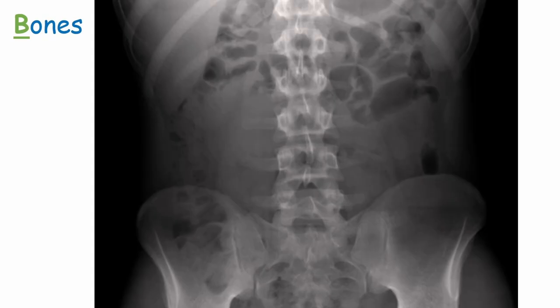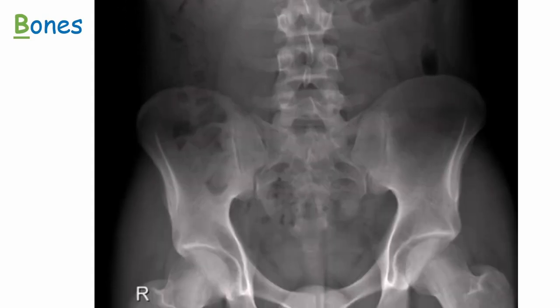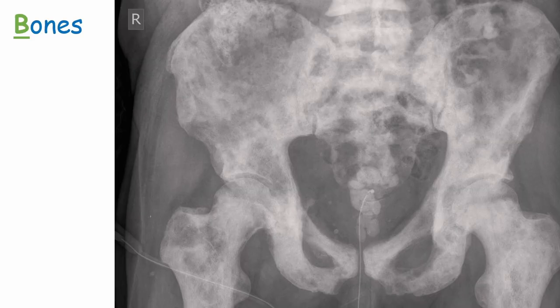The next B is for Bones. On an abdominal x-ray we should be able to identify the lower ribs, the five lumbar vertebrae, sacrum, coccyx, pelvis, and proximal femurs. We should look out for any fractures or lytic lesions from bone tumours. For example, a patient with prostate cancer may show bone metastases visible throughout the pelvis, proximal femurs, lumbar spine, and sacrum as generalised sclerosis.